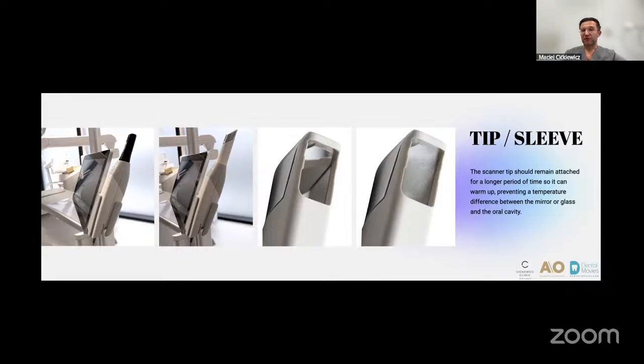And the problem appears with fog on the shield of the tip or the mirror. And the scan will not be so good, not very clear, and it's another big problem, because the scanning will be very irritating.